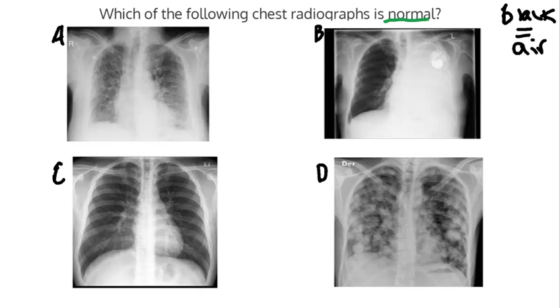It could be the actual organs themselves, such as the heart appearing white, or maybe if you pick up any bone from the ribs. But generally, when you see white where it shouldn't be, where you should normally have air, such as a black part where air would be in the lung, then this would be abnormal depending on the situation. So we'll discuss as we go through each of these options here.